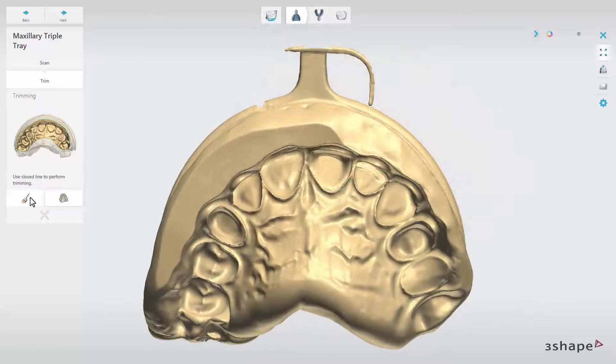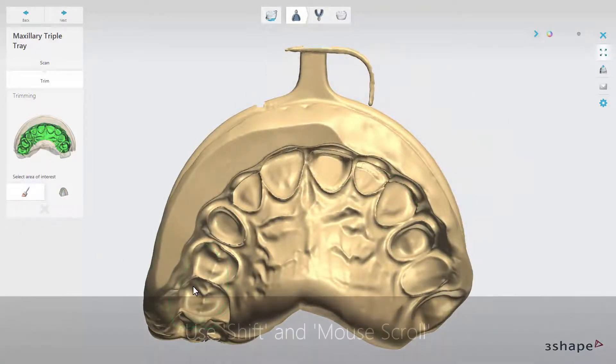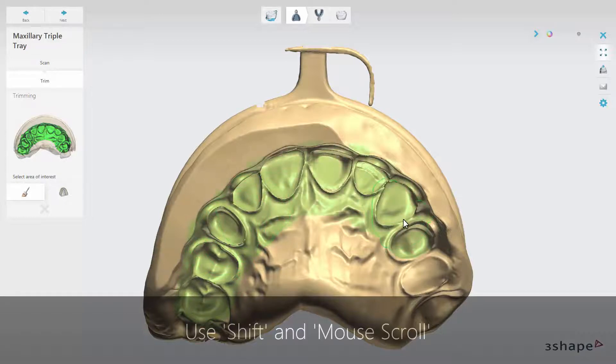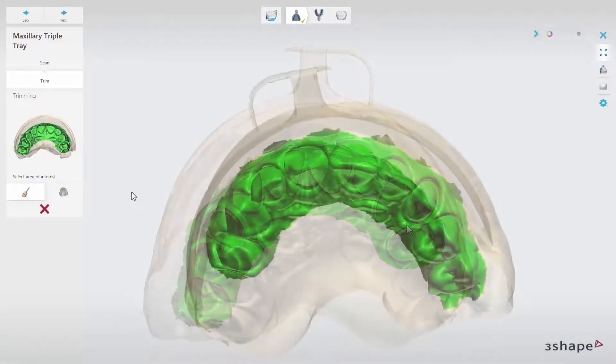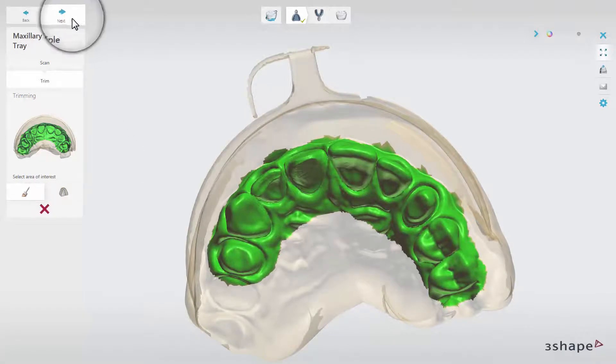When you use selection mode, paint over the area of interest. Use Shift and the mouse scroll in combination to change the radius of the tool. When you have made your selection, click Next.